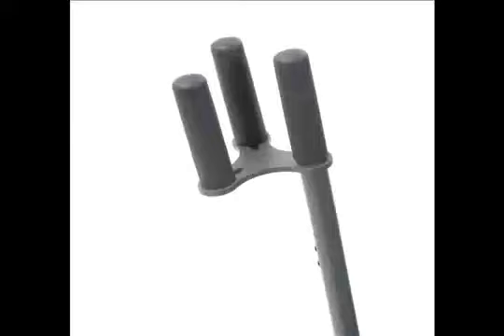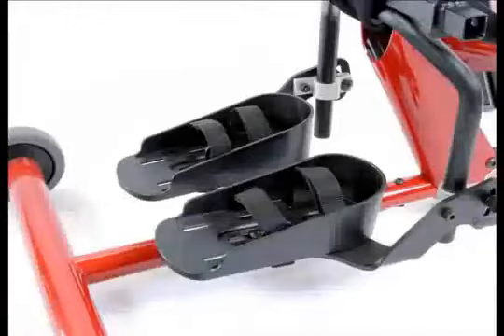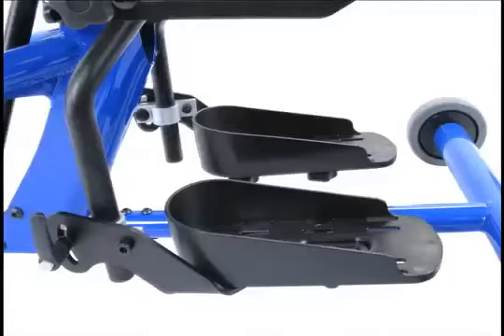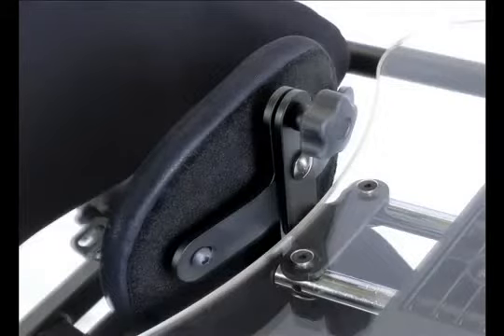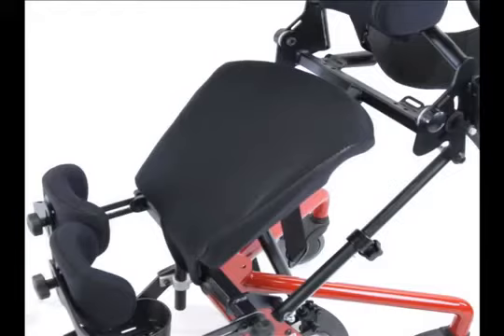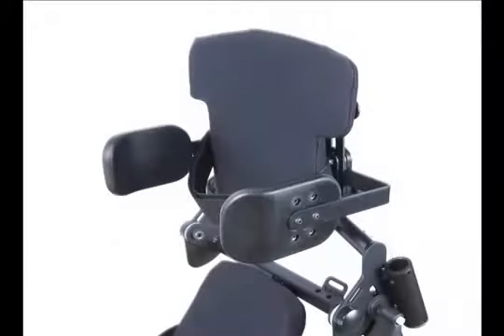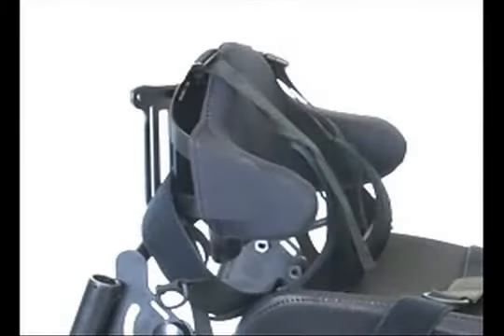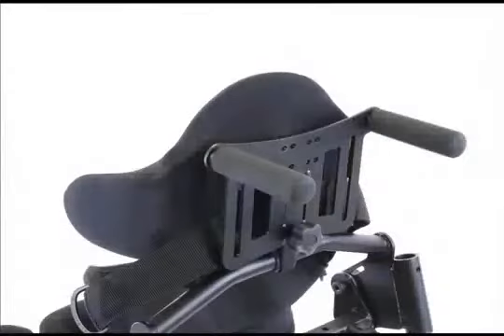Other options for the Easy Stand Bantam include quad grip handle extension, T-style handle extension, foot straps, multi-adjustable foot plates, multi-adjustable knee pads, hand grips, adjustable chest pad, comfy seat and back, hip supports, lateral supports, chest vest, head support, positioning belt, push handles, and more.